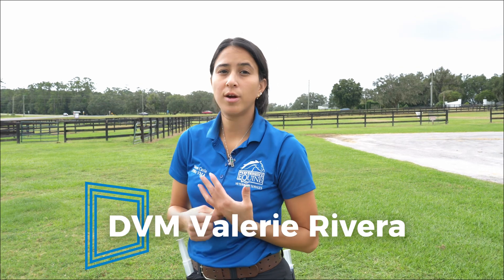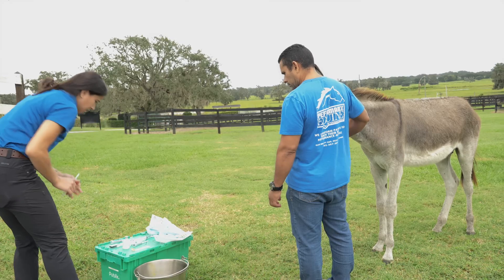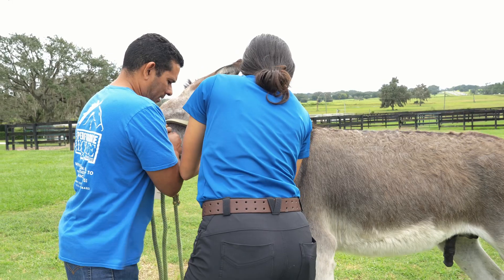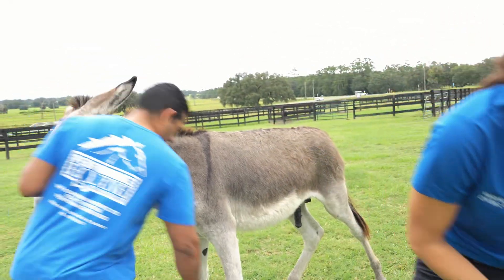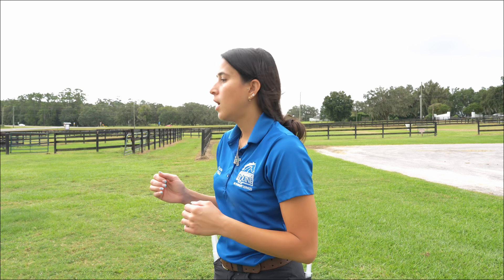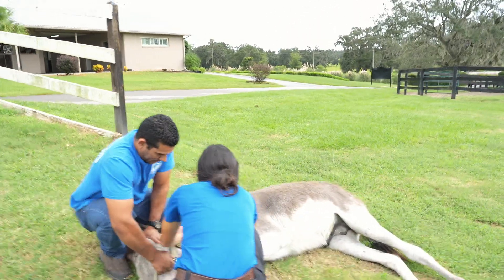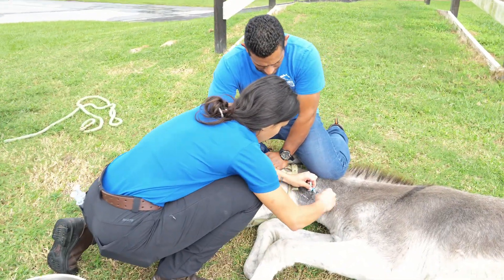We just pre-medicated and did some induction for general anesthesia. We're doing a field castration today. Once we do the pre-medication and induction, as you can see Damon is holding the head up. By holding the head up, the patient is balancing himself slowly and going slowly downward, and after that the patient is going to be on the floor and we're going to do the field castration calmly.